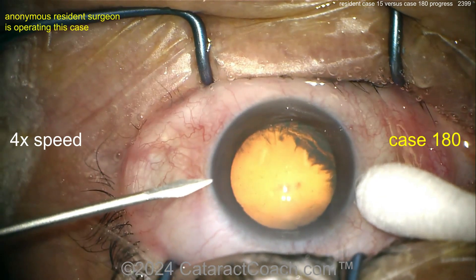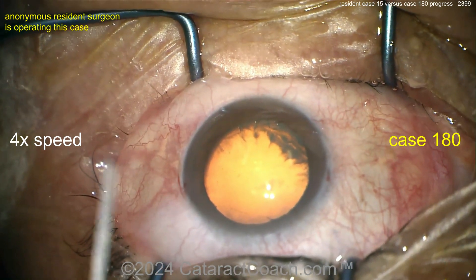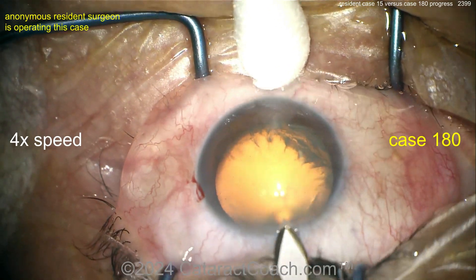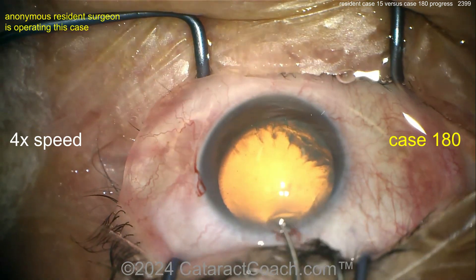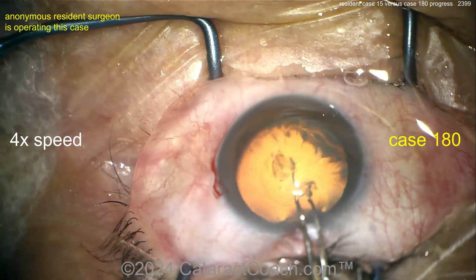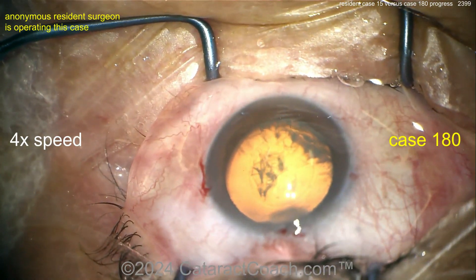Same resident, case 180. Again, pretty good draping. Here comes a para — another para — at four times normal speed. Viscoelastic going in, that's all pretty good. No need for trypan blue dye in this case. Let's see the incision — that's a little bit better. I like that one better, barely nicking the limbal vessel, so that improved. Let's see the rhexis going with forceps, grabbing the capsule — a little bit better, but still kind of a baby rhexis.